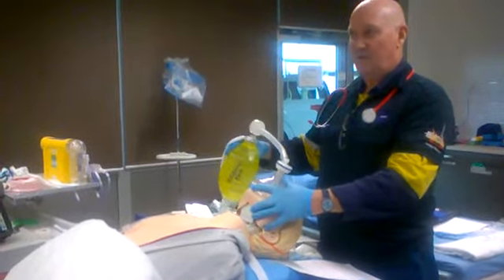Lift up. So as I said, I've prepared a smaller tube for this mannequin. So we'll insert this tube here, in there, and inflate the cuff. Gently inflate the cuff. Quickly we'll hook up capnography from the other machine and bag the patient.